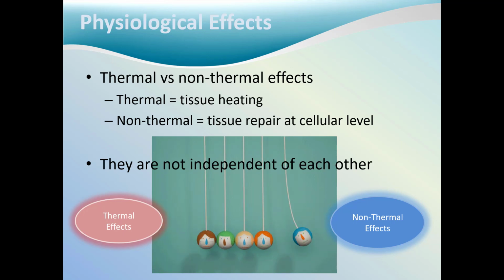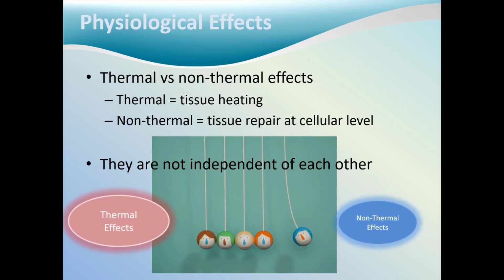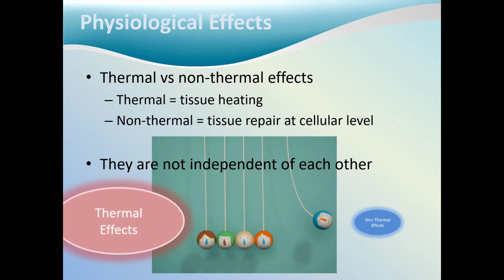The thermal and non-thermal effects are not independent of each other. Rather, they both occur in some capacity, but with different settings, more thermal or non-thermal effects may be seen.